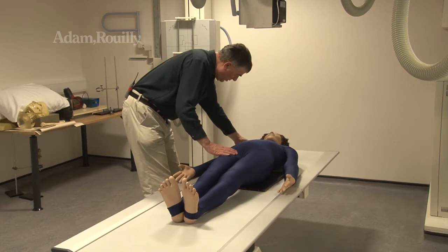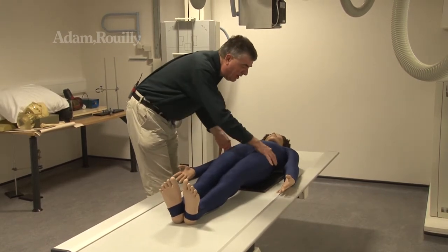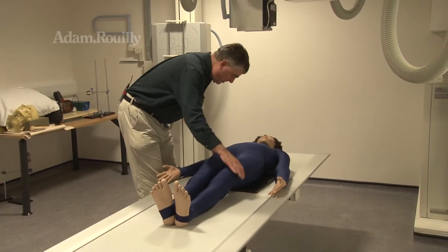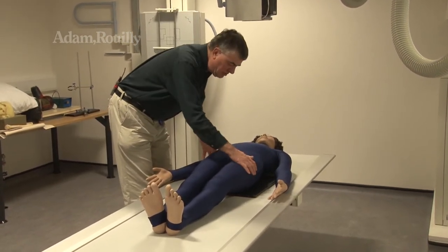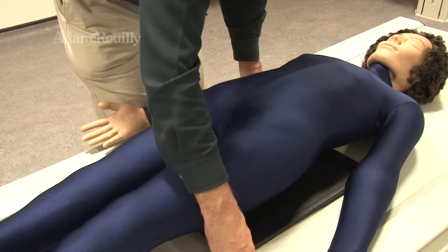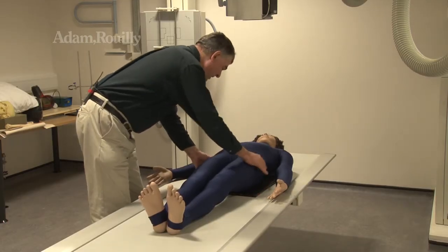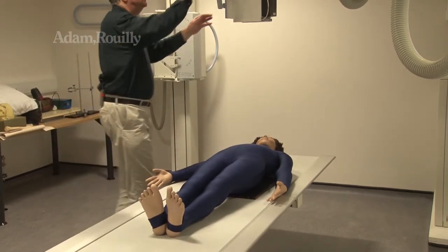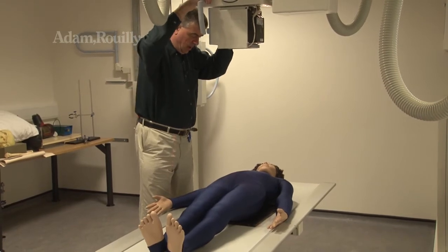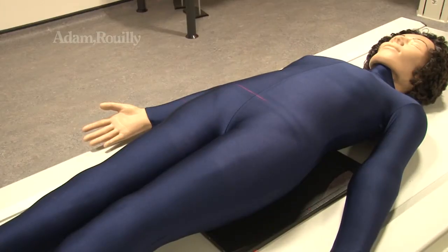So I'm making sure we've got the overlap sufficient by palpating, pressing various bony landmarks, which is what we have to use in radiography to find various parts, and then to make sure that the hips look flat. And again, to use the X-ray tube to center appropriately to include the required area of interest.